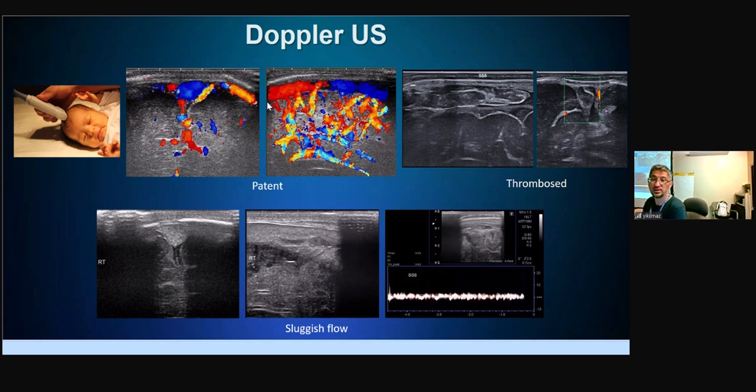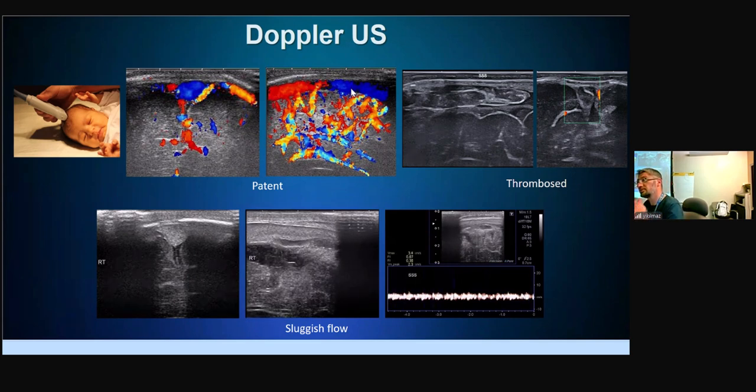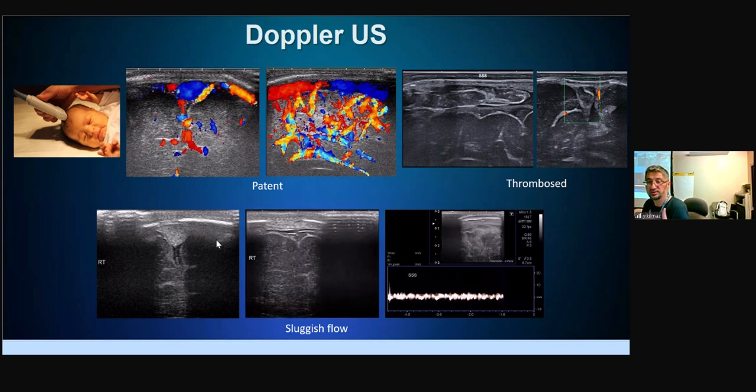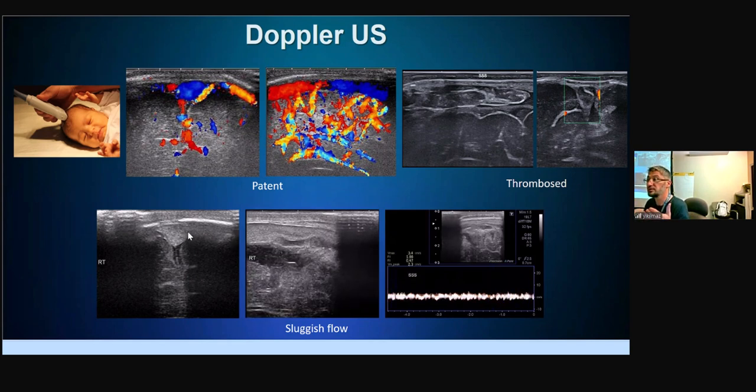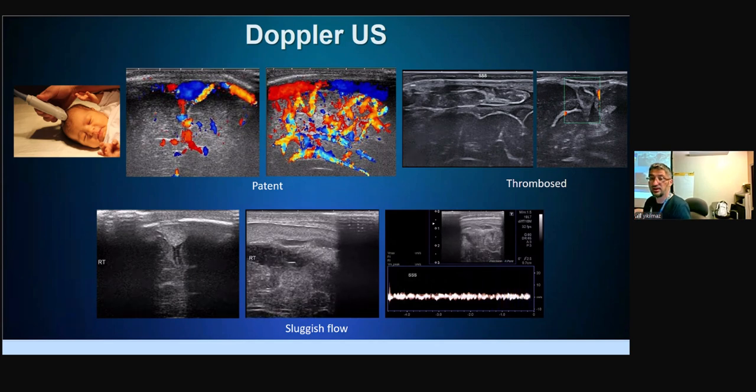We are not even doing the assessment of the superior sagittal sinus routinely. If you see some sinus images, don't report it. We are just getting those images to show you the extra-axial CSF spaces, not for the superior sagittal sinus. The assessment of the superior sagittal sinus might be difficult, because if you compress your probe a little bit too much, then you may think that it's obstructed, but it's not.